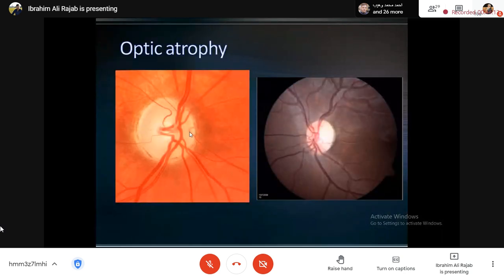Yalla, Ahmed Muhammad, describe this fundal image in front of you. Doctor, we start with the optic disc. This optic disc is a clear, well demarcated optic disc. And its color, meaning how is it, more white or pale. Right, your answer is correct. So thank you Ahmed.